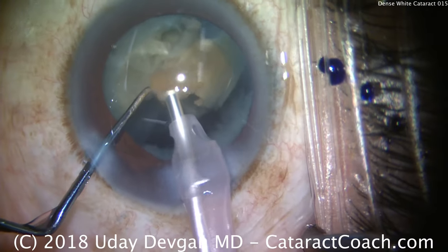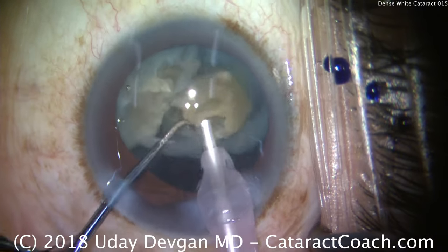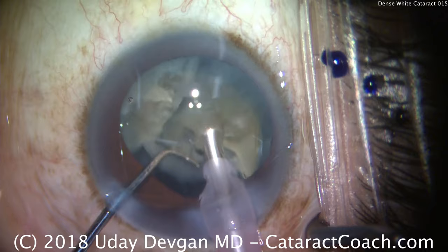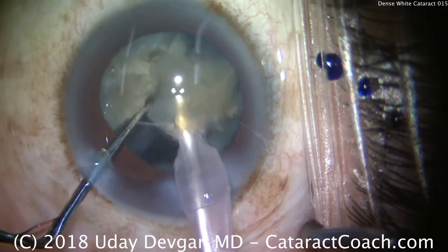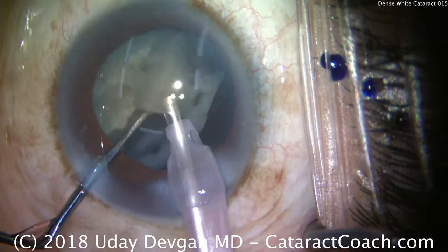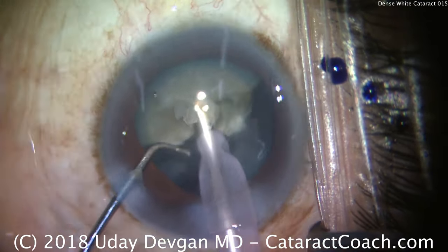Remember, because there is very little cortex in these white cataracts, there may not be much lens material weighing down the capsule or bag. So as we remove these last pieces of nucleus, you could have the capsule or bag coming forwards. But we'll just take our time. Again, we're only applying phaco energy judiciously — only when the nuclear piece is right at the tip.